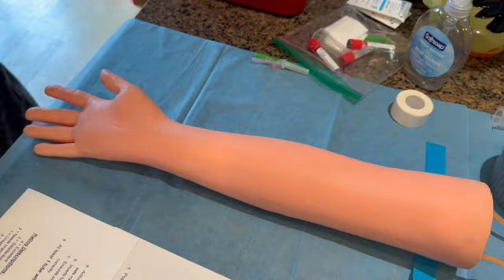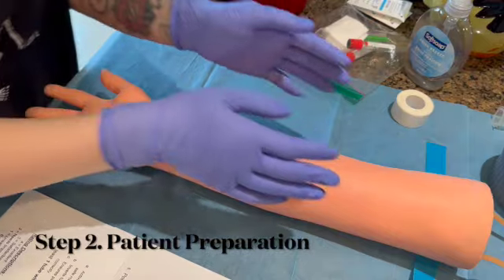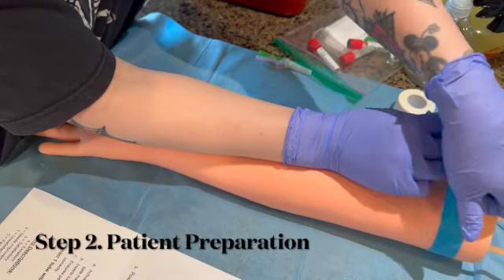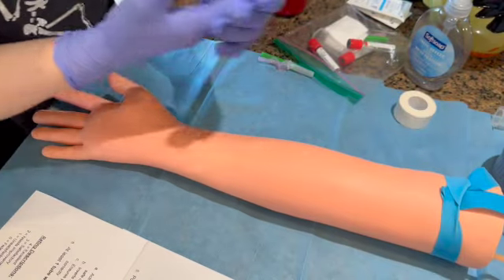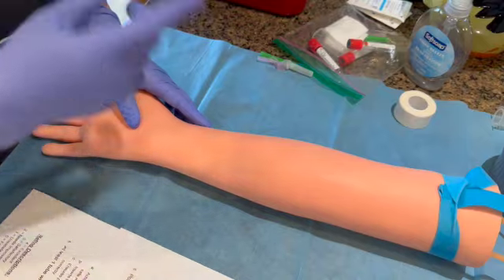Next step, number 2, is patient preparation. So I'm going to be applying the tourniquet properly and at the appropriate location. He is not the easiest to tie a tourniquet on because of the fact that he has a rubber arm. So we're going to do our best to mimic tourniquet tying here. So that's on him. And it is okay if you need to take this tourniquet off and reapply it.